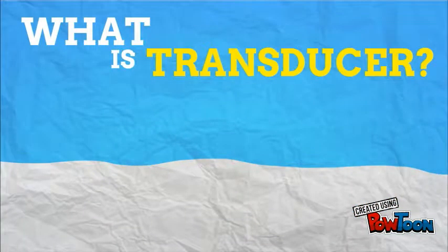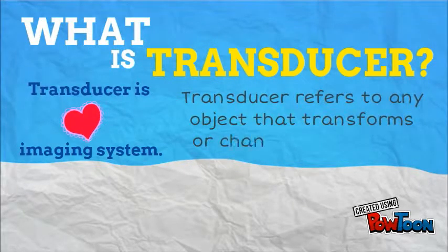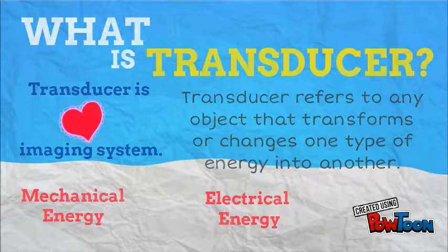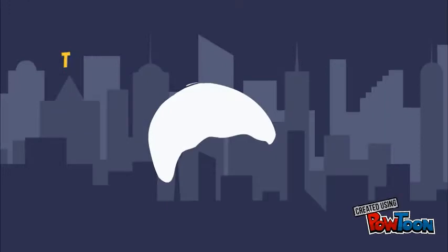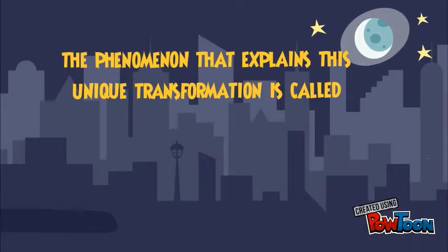So, for the introduction, what is a transducer? For all diagnostic ultrasound applications, the transducer is the heart of the imaging system. Transducer refers to any object that transforms or changes one type of energy into another. The phenomenon that explains this unique transformation is called the piezoelectric effect.